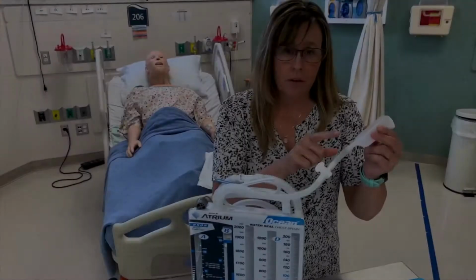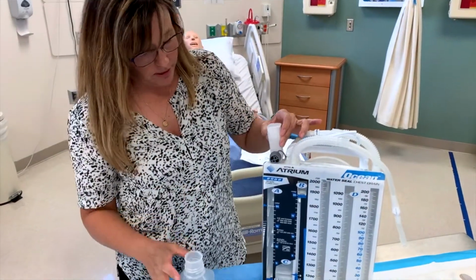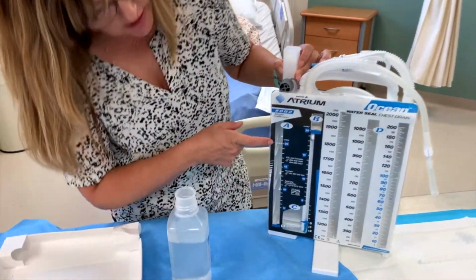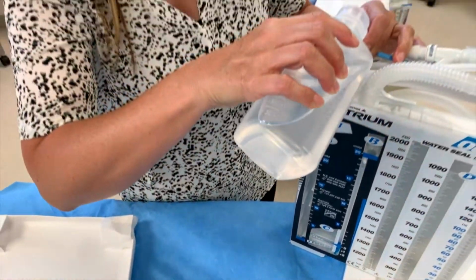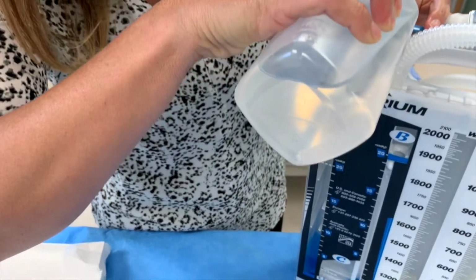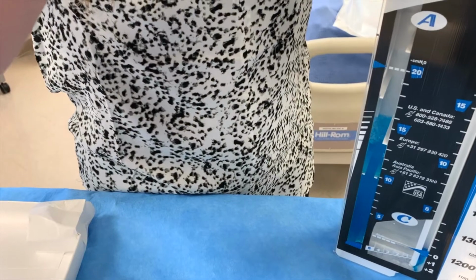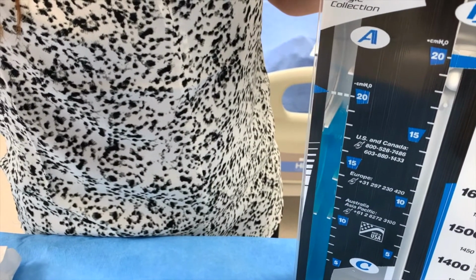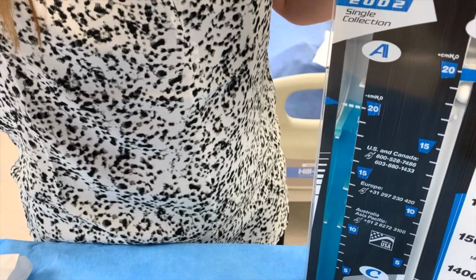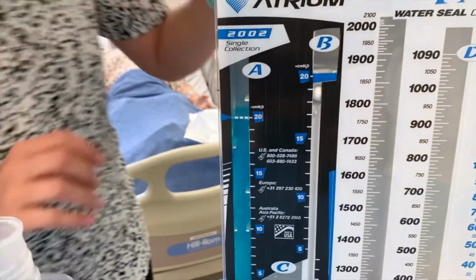All right, now we're going to go ahead and take our funnel off. We're going to fill up our actual suction control chamber. All right, guys, so this is the one where we need to fill it up to that 20 centimeter level. This is where we'll fill that one up. So we need to continue to fill this actual suction control chamber until it reaches that 20 centimeter mark. Boom, just like that. All right, there we go. It's like butter.